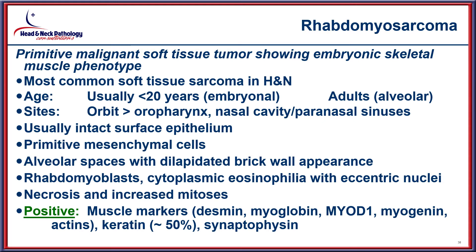Rhabdomyosarcoma also needs to be considered as a primitive soft tissue malignancy in this location, since the head and neck is one of the most common sites. The embryonal type is usually seen in younger patients, while the alveolar type is seen in adults. The alveolar type fits this differential, with primitive mesenchymal cells arranged in a dilapidated brick wall appearance as they collapse from alveolar spaces, comprised of rhabdomyoblasts, cytoplasmic eosinophilia, and eccentric nuclei. They are also reactive with muscle markers and positive for keratin and synaptophysin in a fair number of cases.